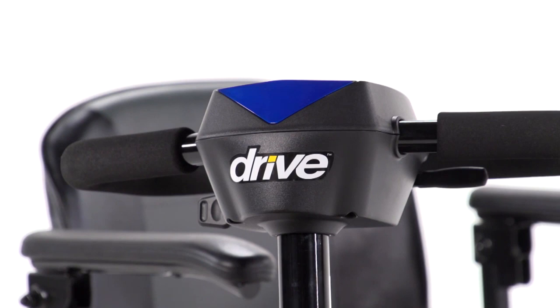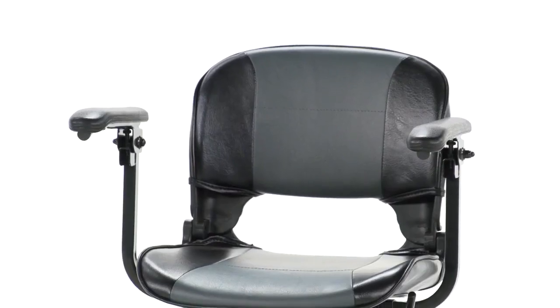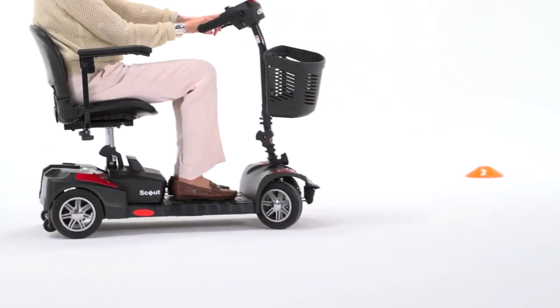For a deluxe appearance, the Spitfire Scout Deluxe 4-wheel version includes interchangeable shrouds with a high-gloss finish, attractive two-tone seat upholstery, and metallic wheel rims.